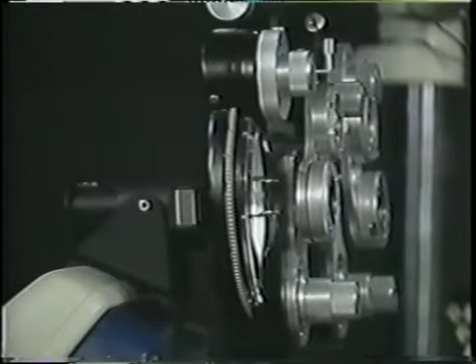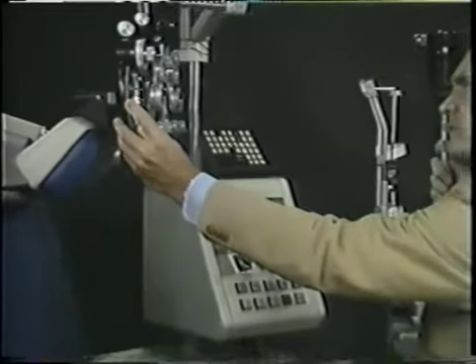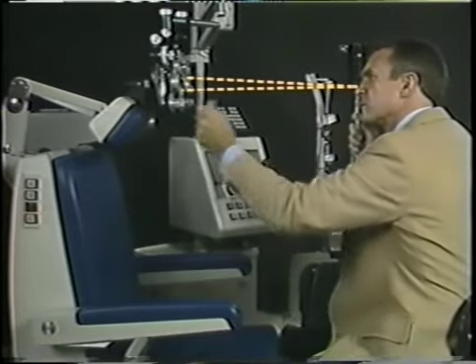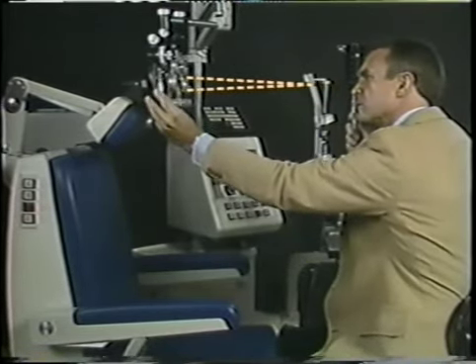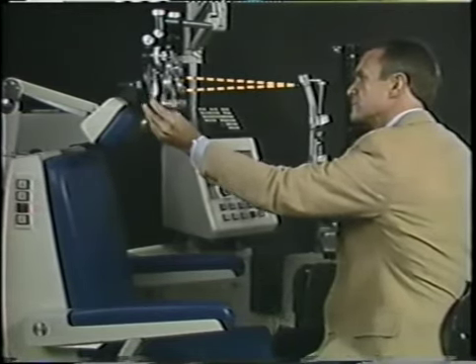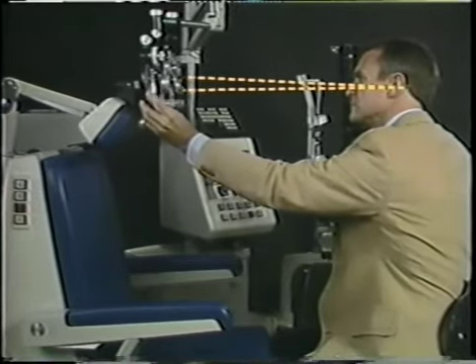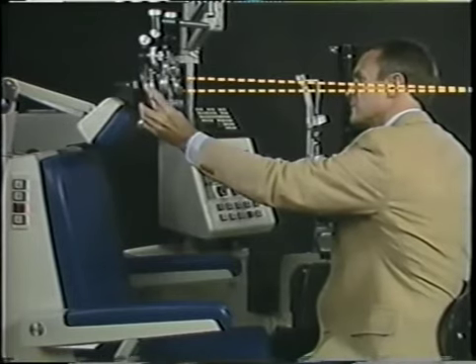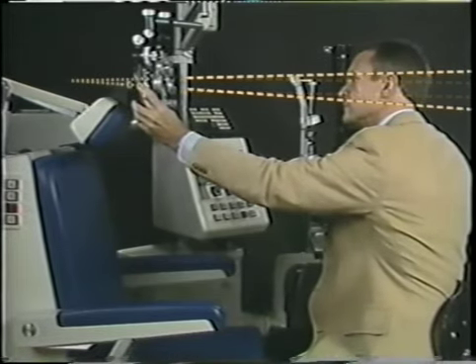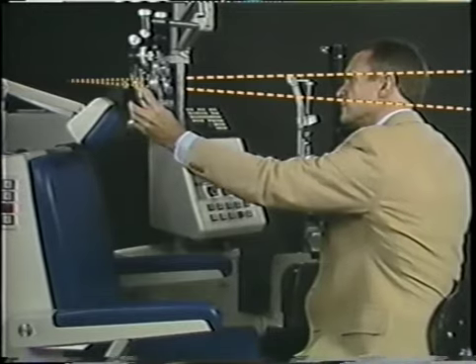The whole point of the neutralization technique of retinoscopy is to use lenses to bring the eye's far point to the peephole of the retinoscope held at the normal working distance. Adding plus lens power, dialing down on the phoropter, pulls the far point toward the eye. Going in the minus direction, dialing up on the phoropter, moves the far point away from the eye. The far point can be moved beyond the retinoscope to infinity and even beyond infinity by continuing to dial up on the phoropter. The far point beyond infinity is actually a virtual far point behind the eye.